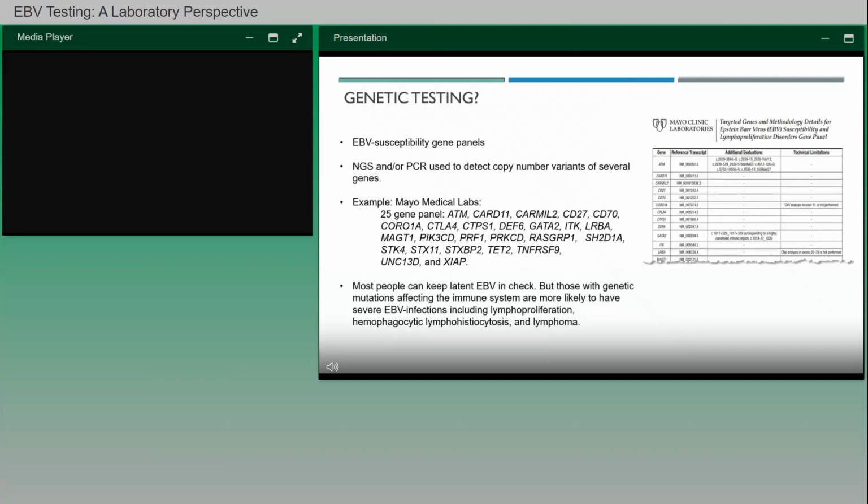So they're looking for genetic variants that will unmask or reveal that the patient has an impaired immune system, okay, which would make them more susceptible to EBV. So it's an EBV susceptibility panel, okay? So pretty interesting. Obviously going to be a very esoteric use, very, very limited and rare use, but might help with the workup of some complex patients.